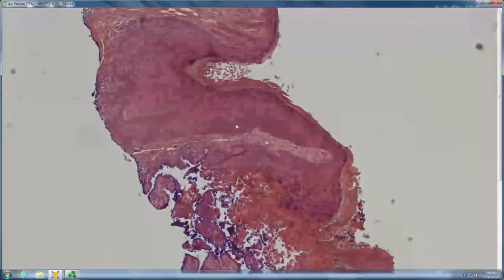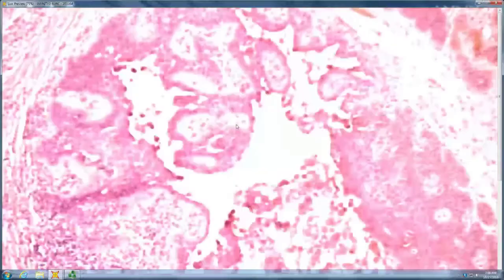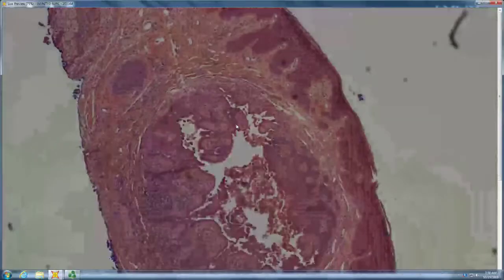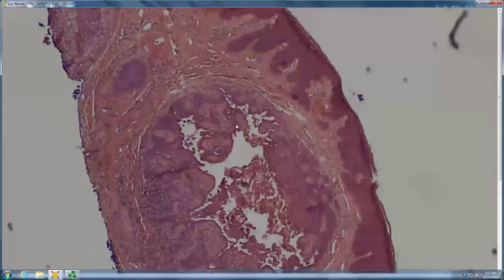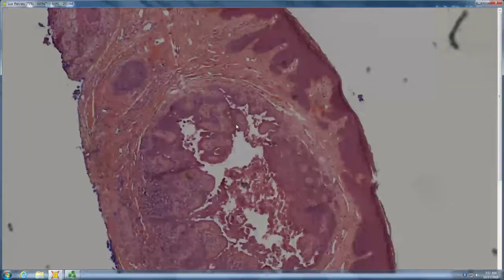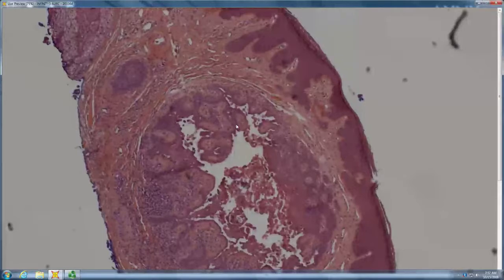So they're not just red, right? They're blue, clear. Grovers, Dariers, but if this is a solitary lesion, then she knows that diagnosis. Yeah, correct. So, as Victoria said, warty dyskeratoma.